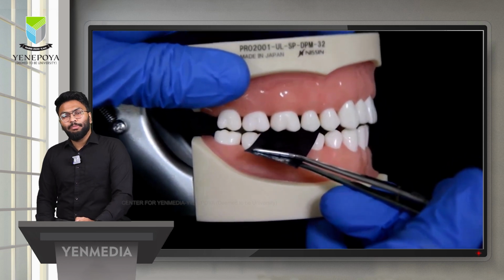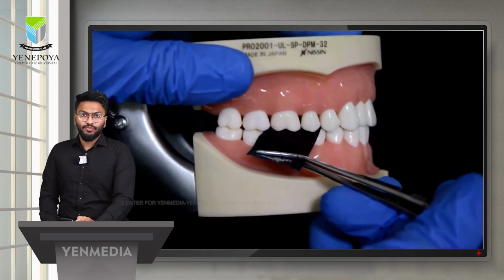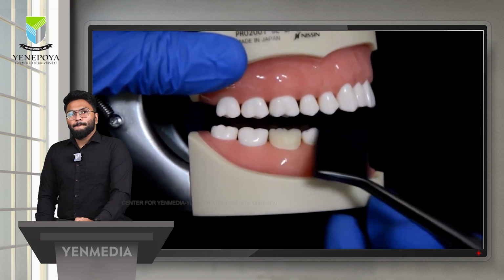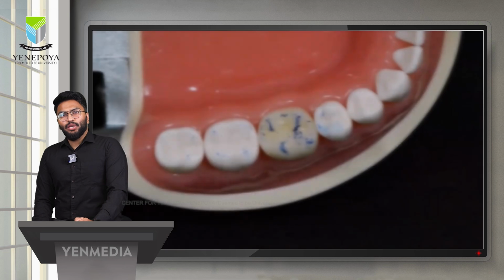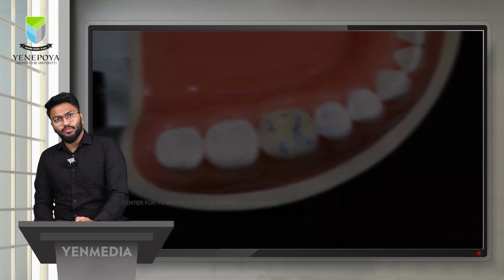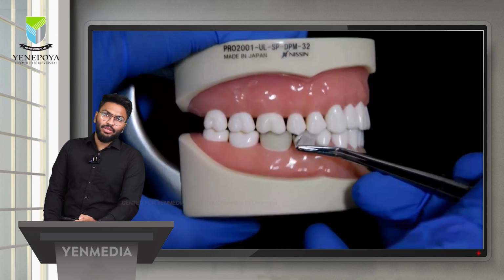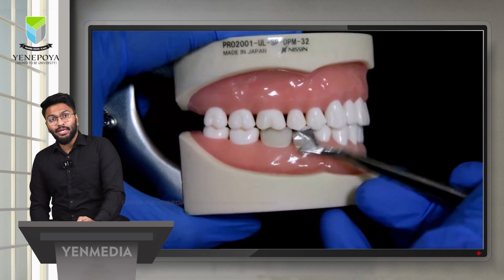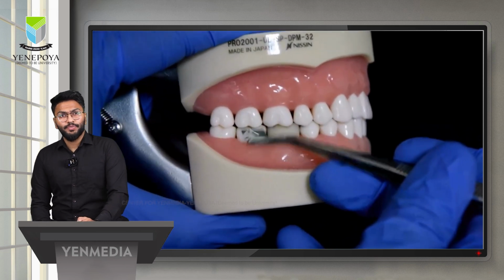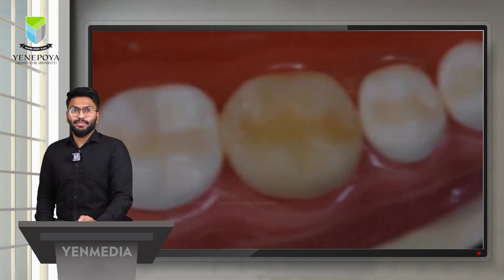So we are placing an articulating paper. After placing the articulating paper, we are seeing where the high points are. We are locating where the high points are. Once the high points are located, we are going to trim down those areas. Once trimming is done, we will again recheck with the shim stock on the adjacent tooth. You can see that the foil is not coming out. It means that there is proper occlusal contact. This is how you check for your occlusal contacts.